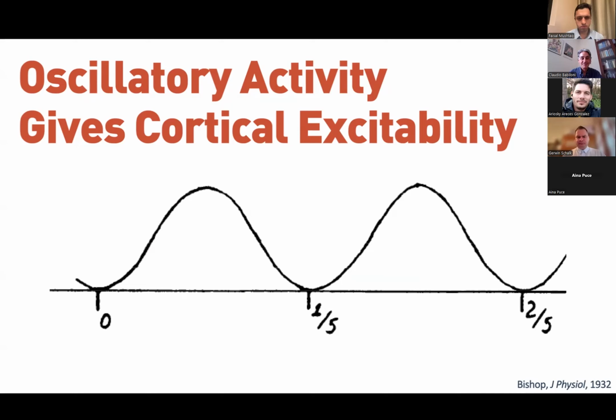Today we don't think about amplitude. Most people measure oscillatory activity by measuring oscillatory power, which is really the envelope, basically the peak to trough amplitude, or the phase, which is a whole other topic. I strongly believe that measuring things by power and phase doesn't really make much sense. Going back to just measuring the amplitude is much more closely related to the actual physiological process, but that's a whole topic in and of itself.